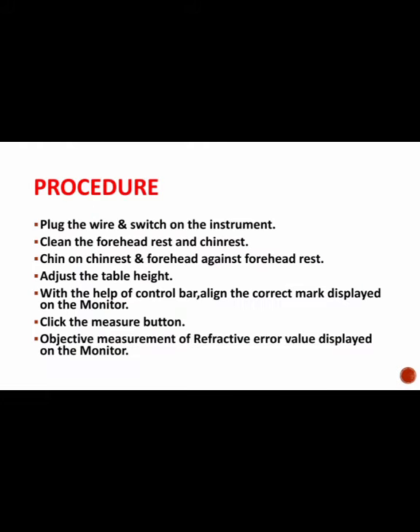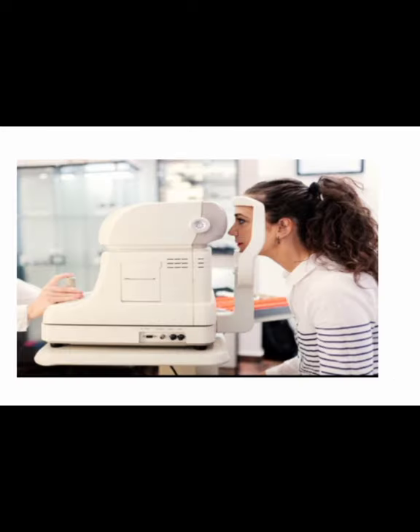Next we are going to see the procedure of autorefractometer. First we need to connect the instrument to the switchboard and switch on the instrument. Next, clean the forehead rest and chin rest. Ask the patient to keep chin on chin rest and forehead against forehead rest. See the picture here — like this only we need to align the patient.